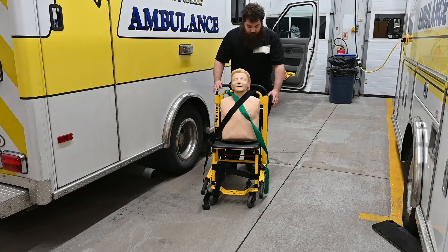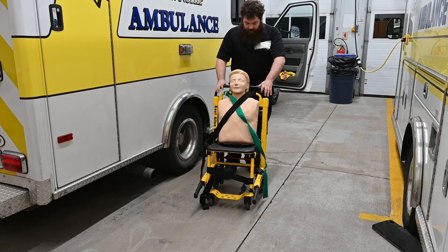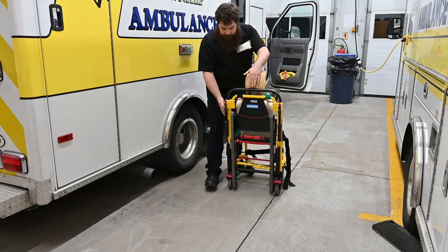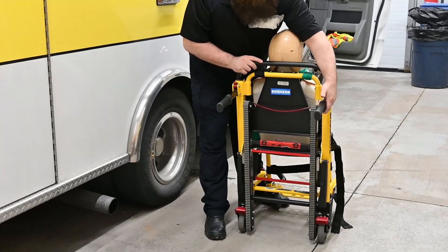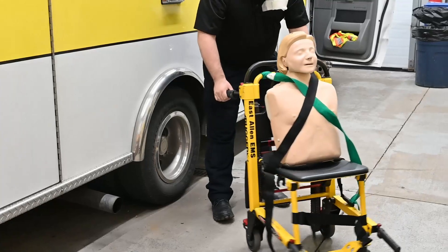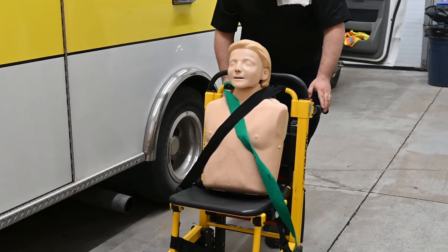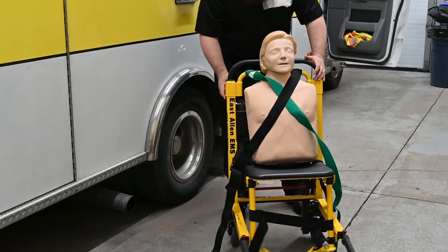So I'm going to unlock the wheels here, and we'll spin this around. You have your two hand rails which just slide up inside — very good — and then it basically acts just as a normal wheelchair. We're wheeling grandpa down the road, and that's how we get them out.